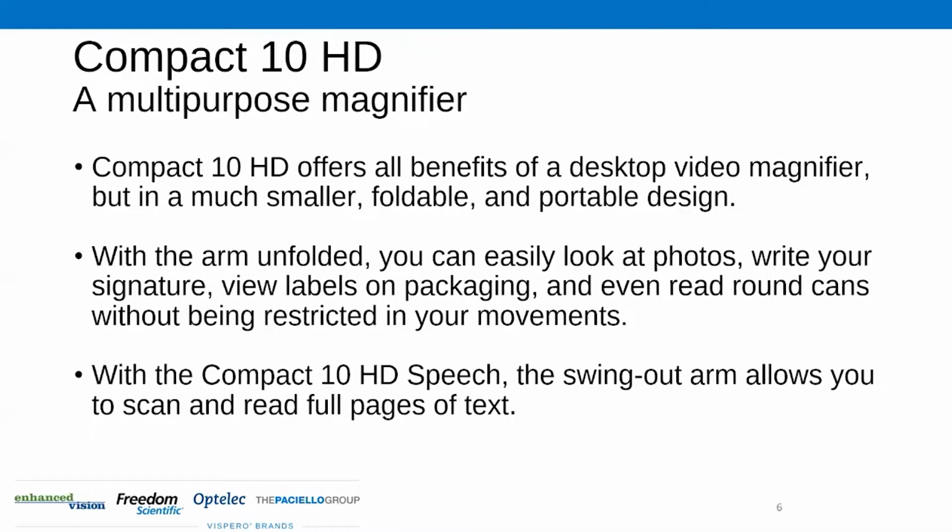So the thought process that went into the development of this product always impressed me, because it's not easy having 3 cameras, and then on top of that having an intuitive way for the user to be able to get to use each of those modes. Because what we don't want to do is have the user having to switch from one mode to a different mode, based on the task that they're trying to do. So this device is fairly smart in that it can detect what mode you're in.